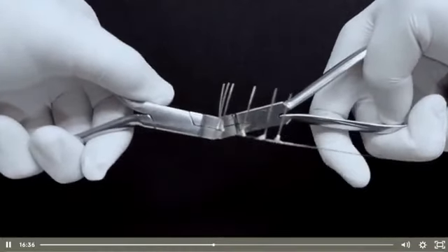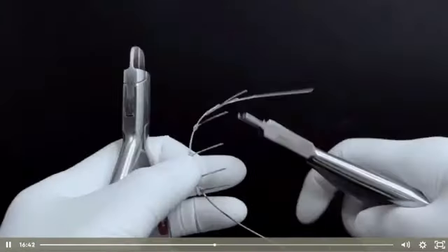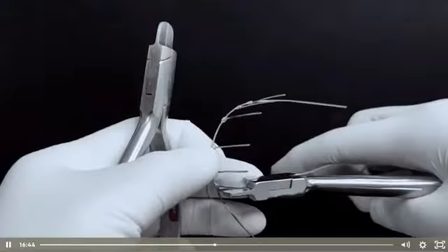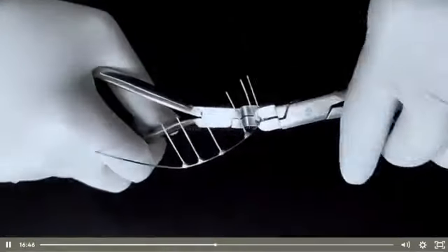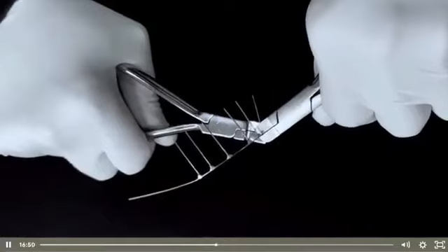You're just applying a twisting between anterior and posterior segment. What you are doing here is really applying the torsion, a negative torque to the posterior segment. That's all. And go to the other side and do the same. So what is the tricky part here?